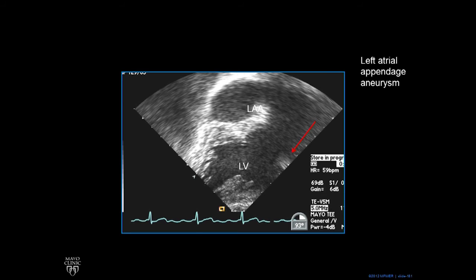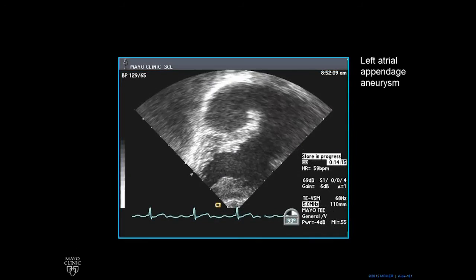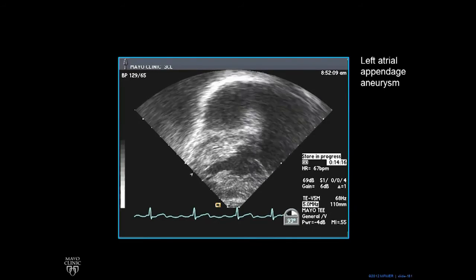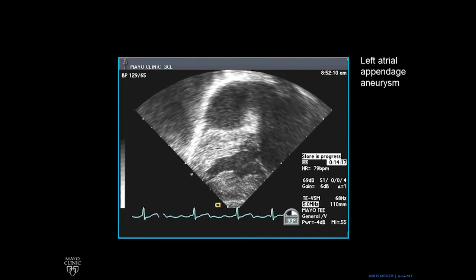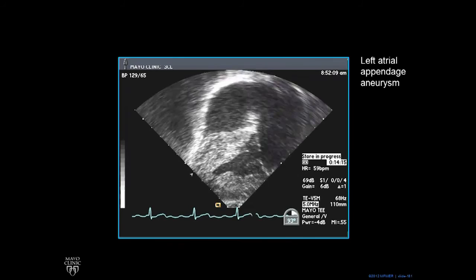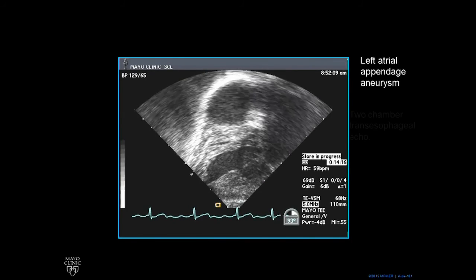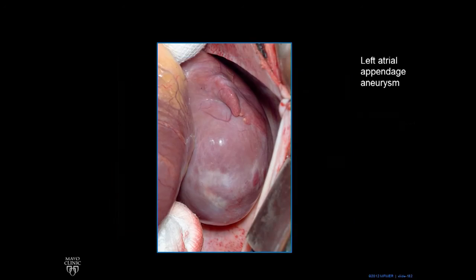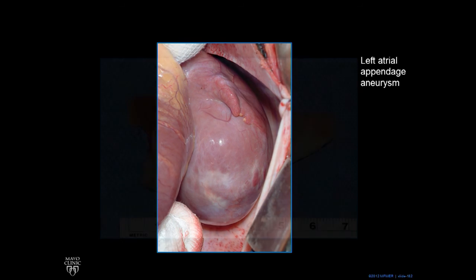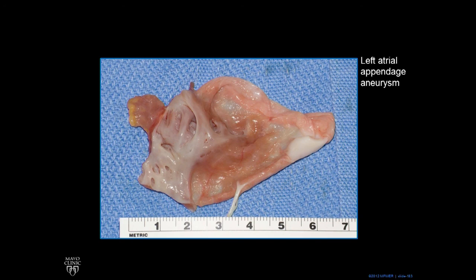Here's a transesophageal echo, where the probe is in the stomach. There's the left ventricle, and then this big S-shaped thing sitting on top of the left ventricle is all left atrial appendage aneurysm. Here's a surgical picture — that big pink eggplant-looking thing is left atrial appendage aneurysm, and when it was taken out, it was about seven centimeters.